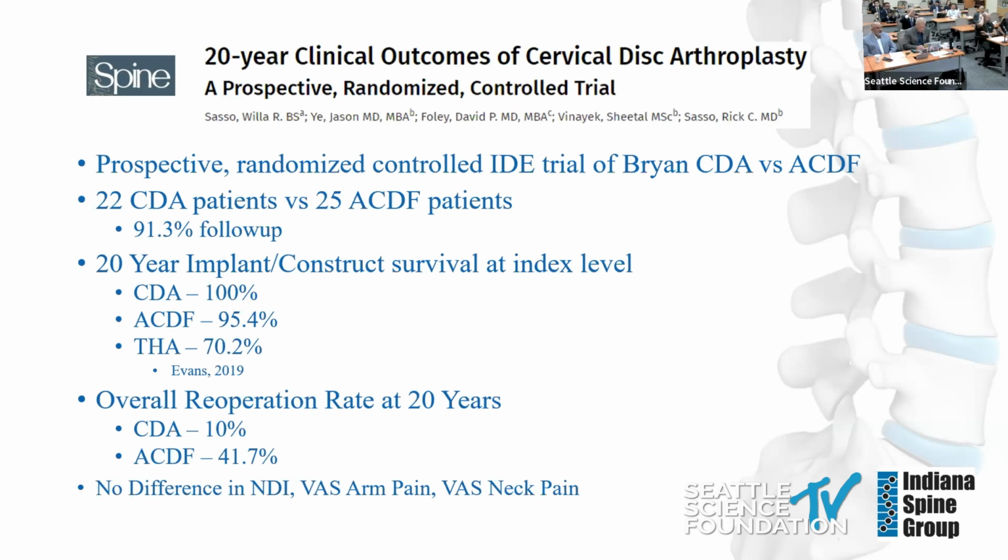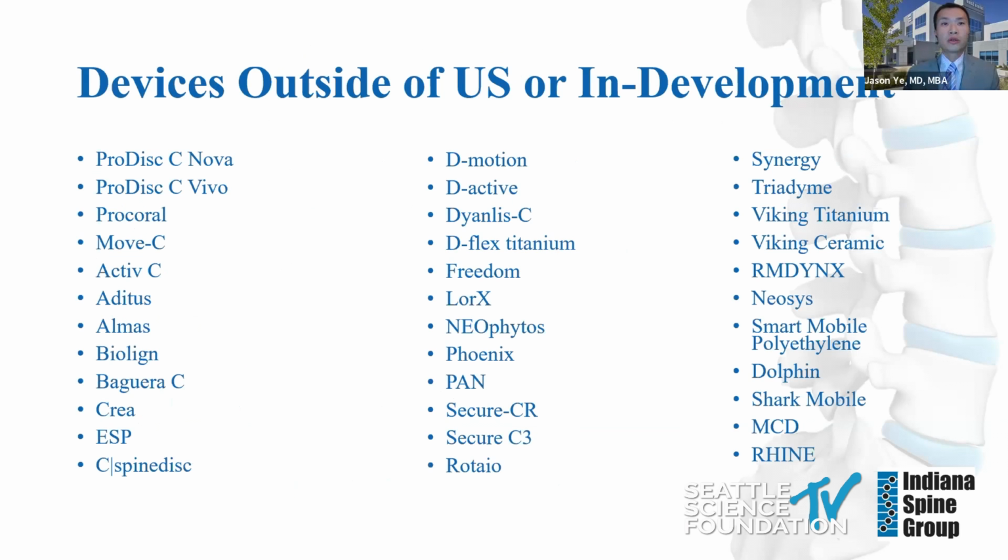Despite a higher reoperation rate in the ACDF group, there was no difference in mean outcome scores between ACDF and arthroplasty at 20 years. Currently, there are over 35 cervical disc arthroplasty devices being used outside the United States or in various stages of development.